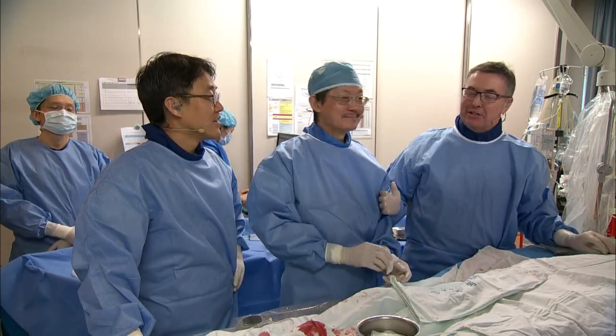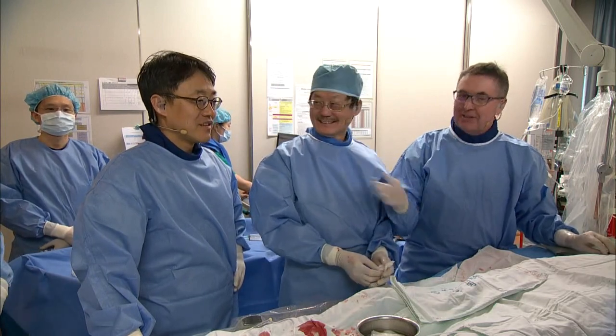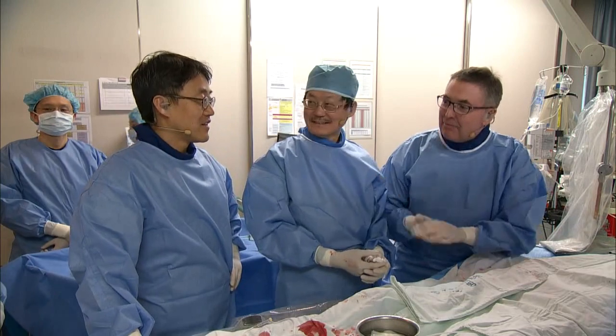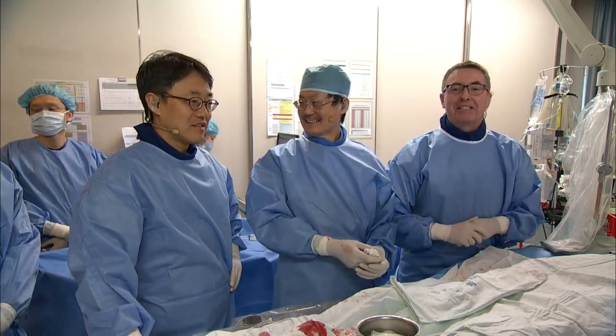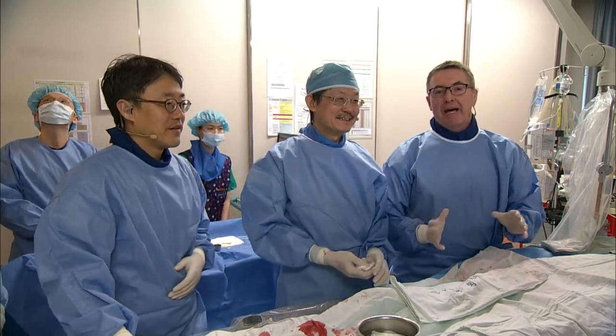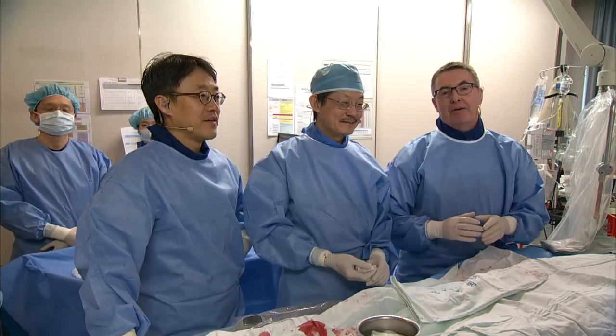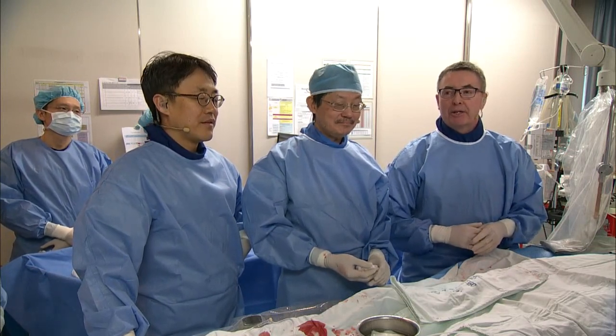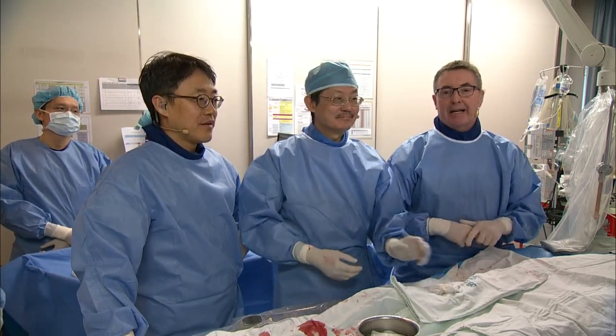I'd like to first introduce my colleague and friend, Dr. Wu, and also Dr. Park, who are going to be assisting me, and the wonderful team here, and Dr. Kang over there, who's running the intravascular ultrasound for us. In short, it's a left main lesion with an LAD diagonal bifurcation very close to the left main origin. So we're going to do a 3-wire technique.